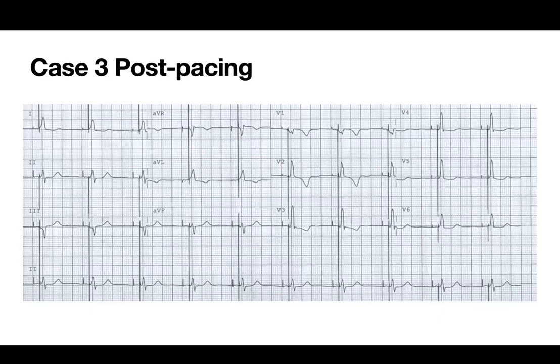Here, there's no R prime. I'm going to get back to the R prime issue, but I find that if there's an R prime or an R in V2 already, there might be a reason why it's not present there. I'm going to talk about it after.